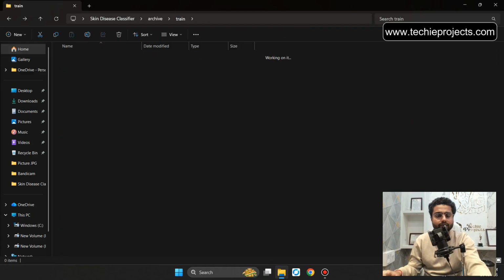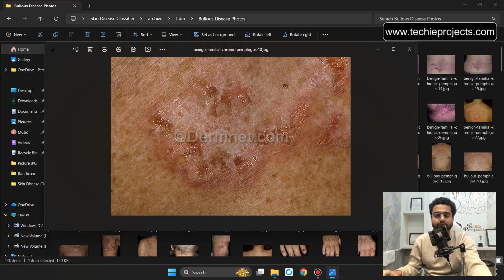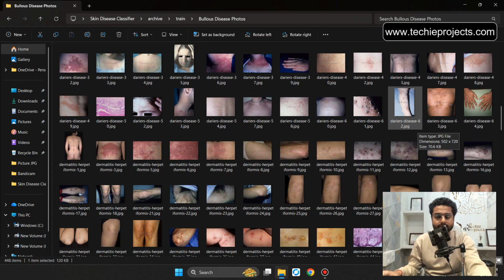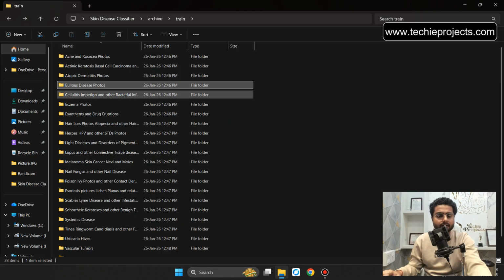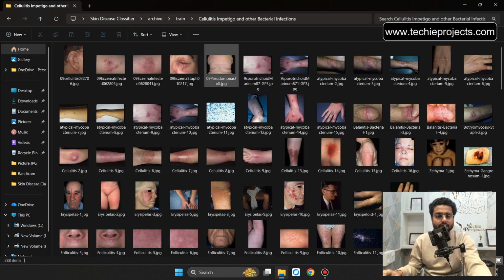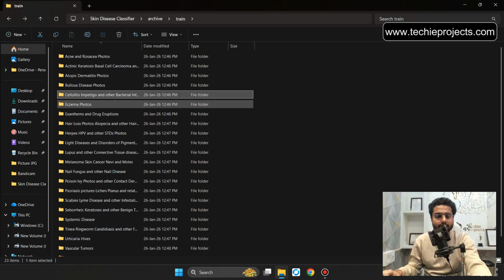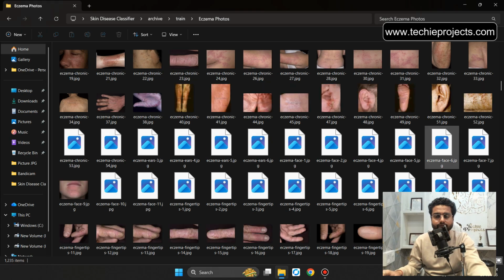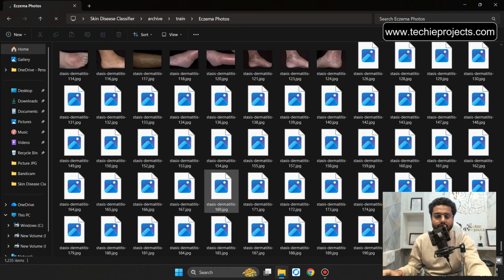Let's go back. Bullous disease photos. It will be a type of that particular skin disease. And the other will be cellulitis, impetigo, and other bacterial infections. This is eczema photos. It will be around 1235 images. So let's fast forward.